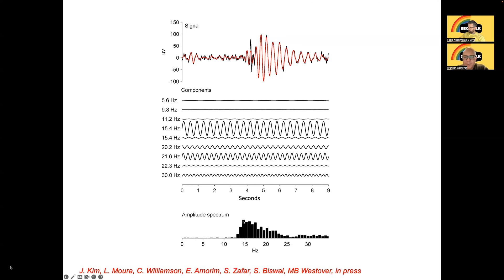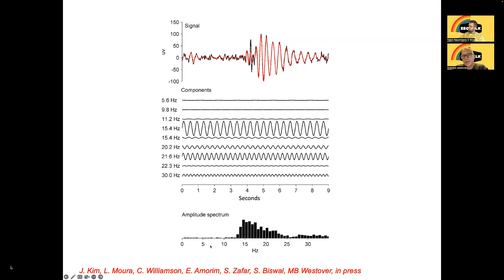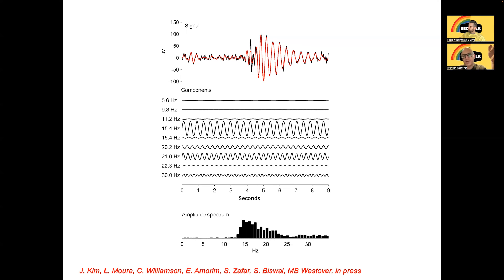You can see there's a high-amplitude component around 15.4 Hz, which corresponds to that prominent sine wave at 15.4 Hz above. Down at low frequencies, say 5.6 Hz, the amplitude spectrum shows very low amplitude — almost no wiggly parts at that frequency. This is a nice easy way to look at the component sinusoids — what their amplitudes are as a function of frequency. We call that the spectrum. Sometimes we square the amplitudes to get power, then take the log, putting them on a decibel scale, which makes them a little easier to look at.